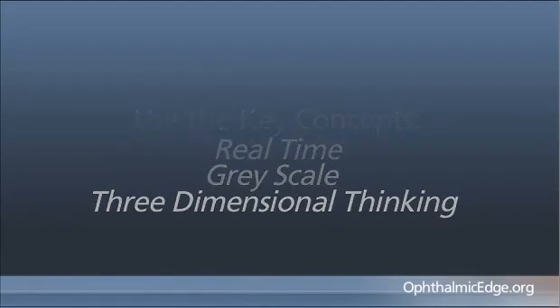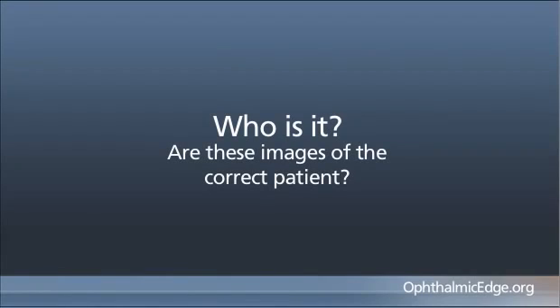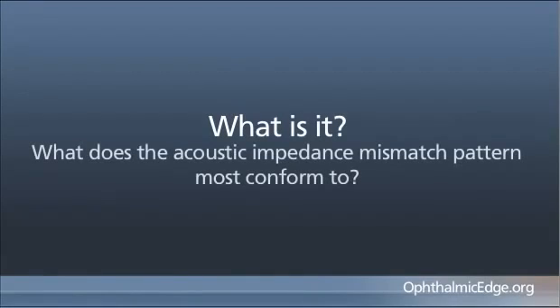I can't tell you how many times physicians and technicians have asked me with a still image, a single still image, Dr. Fisher, would you look at this ultrasound and tell me what the diagnosis is? And I always ask them the following questions. And it is an approach to a diagnosis that I'm aiming at. First of all, who is it? Do we have the images of the correct patient? Secondly, where is it? Where was the probe and what is the view? And finally, what is it? What is the acoustic impedance mismatch pattern most conformed to?